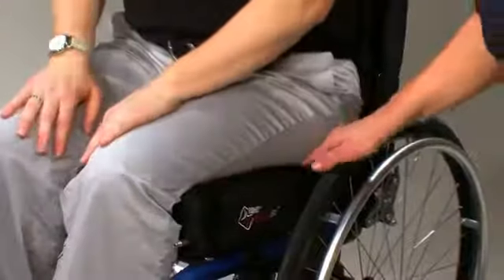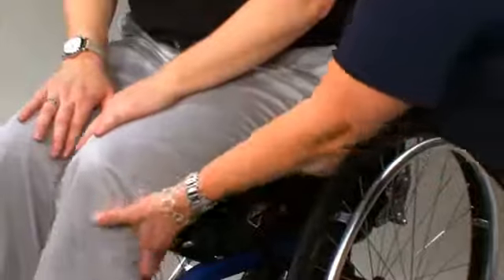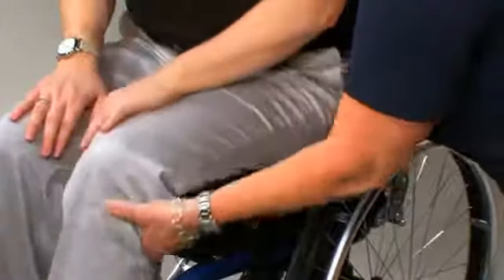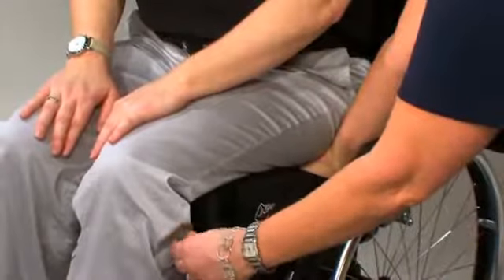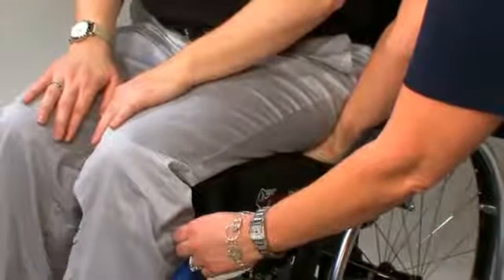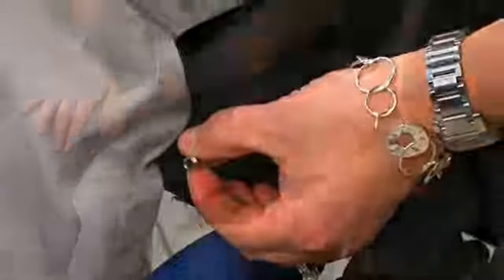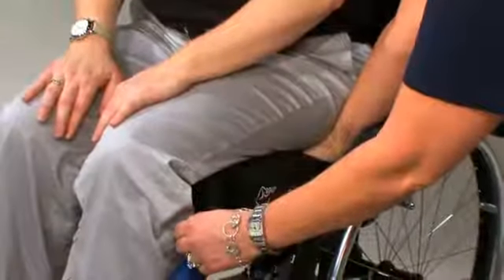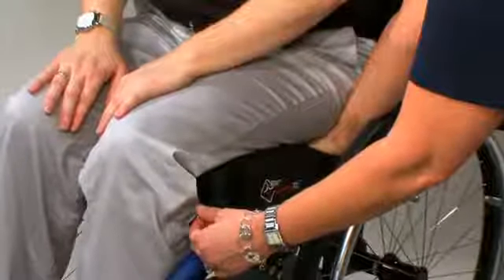Next, slide your hand between the cushion and the individual's bottom. Lift the individual's leg slightly and feel for the lowest bony prominence. Then, lower the individual's leg to a sitting position. Once this has been achieved, turn the valve counterclockwise to let out air while keeping your hand under the user's lowest bony prominence.